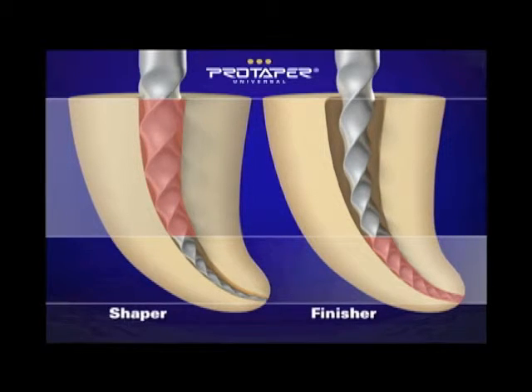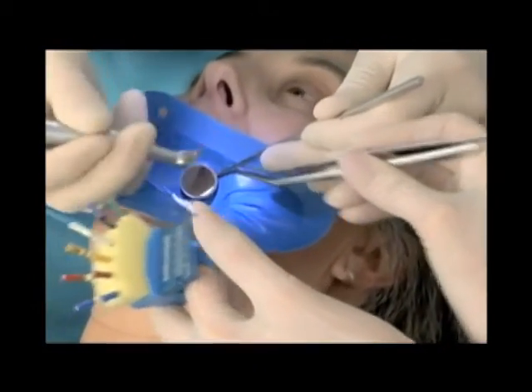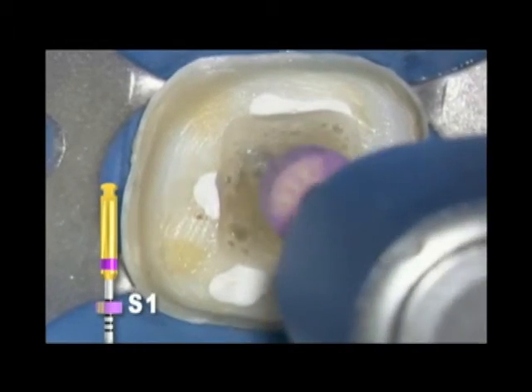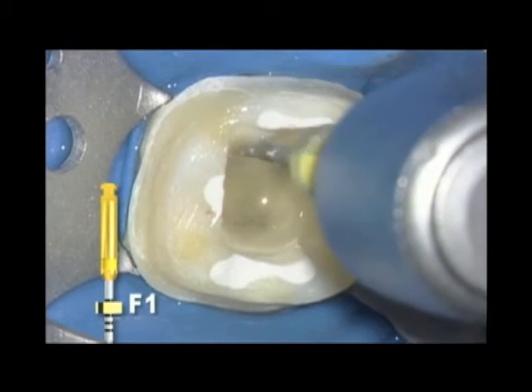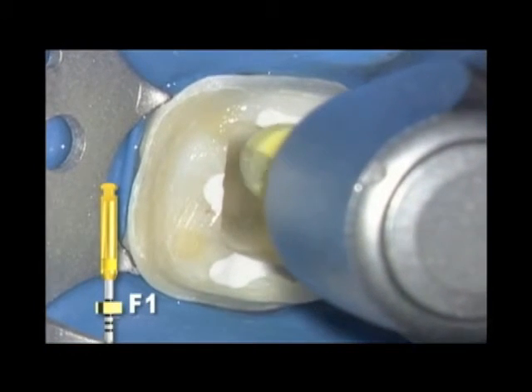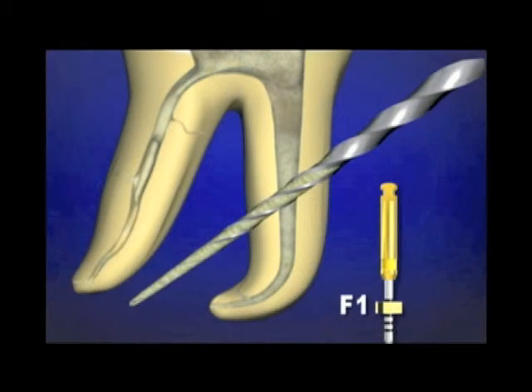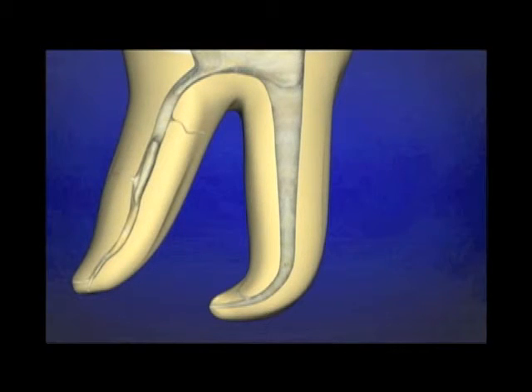That's ProTaper. So if we just looked at it briefly in a clinical op, we could just see a shaper coming in here, but I want to really emphasize brushing. You tell brushing to the masses, and they're doing a little brushing, but they're really not brushing. Brushing makes the lateral space that allows the finisher to move right through the upper 2/3 and do a little job towards its terminal extent. When you pull out these finishers, they're often loaded with debris. There'll be a lot more to talk about finishing criteria.